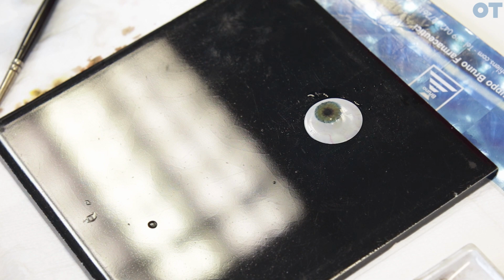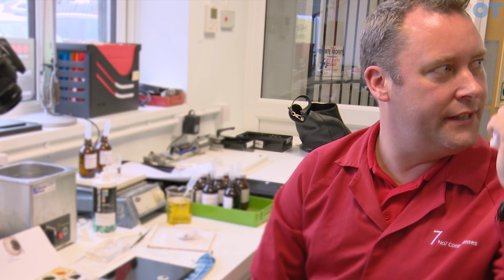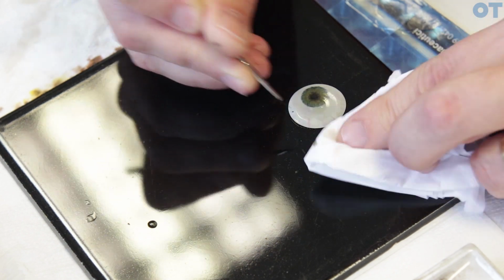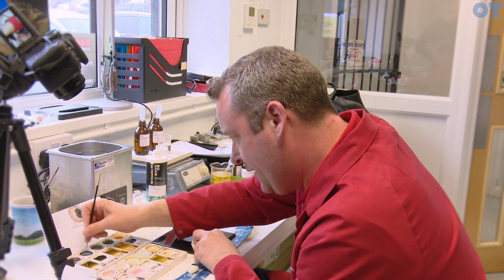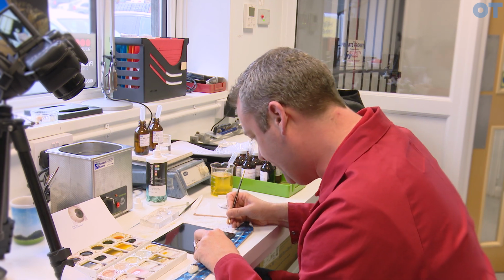We do scleral lenses as well sometimes, where it is literally just the scleral part of the eye. So their normal iris is showing through the lens, and then the outside area you're covering up. You can do just a pupil, you can do just an occlusive lens that's not painted at all, it's just black, with a black back, and that's literally just to occlude light and nothing else. So there are some things I do that are not really for cosmetic coverage, they're literally just for a medical condition.